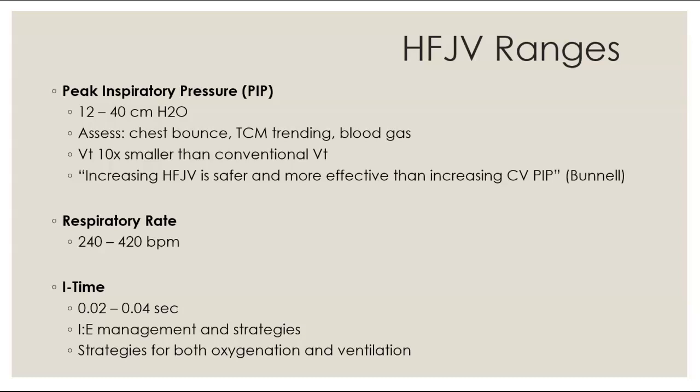A lot of times you'll just kind of match or go around the same PIPs you were getting if you're moving from the conventional ventilator or the high-frequency oscillatory ventilator to the jet ventilator if you need that trick. It's okay to go kind of around there and then adjust up and down as needed based on gases, visual assessment, and TCM readings. We need to assess chest bounce, TCM readings, and blood gas when we're setting up our PIP. It won't go clear to the umbilicus. It'll be a little more subtle than on the high-frequency oscillatory ventilator, but you'll still be able to visually see chest bounce.